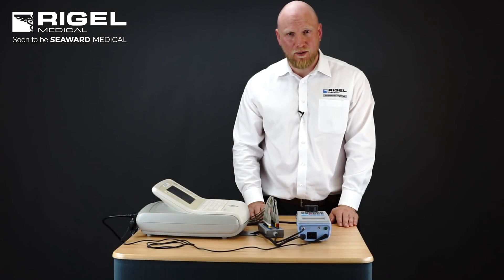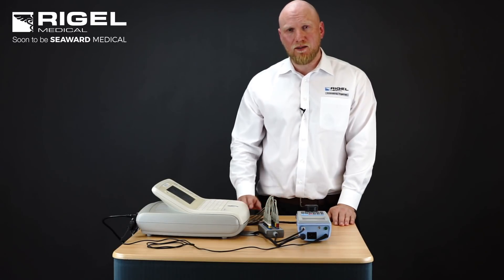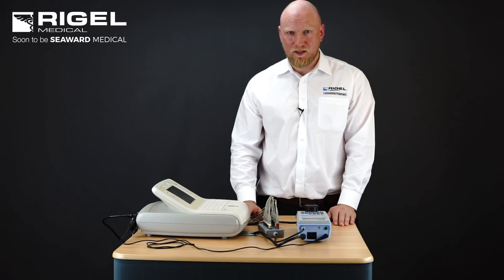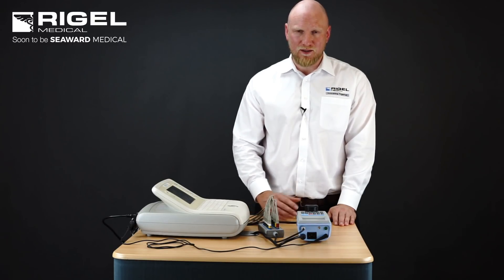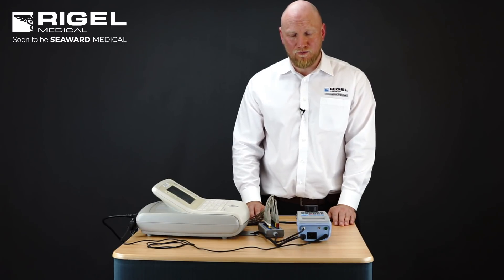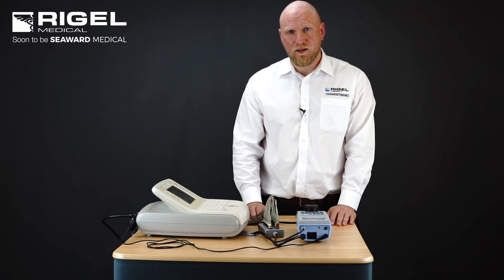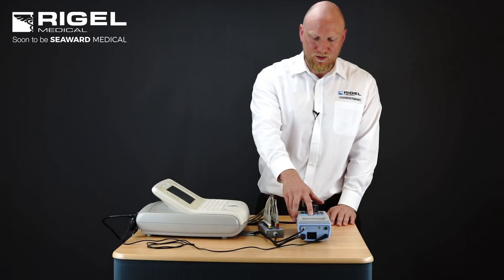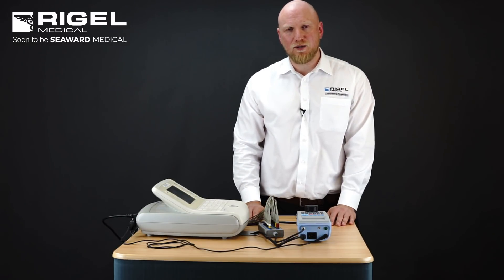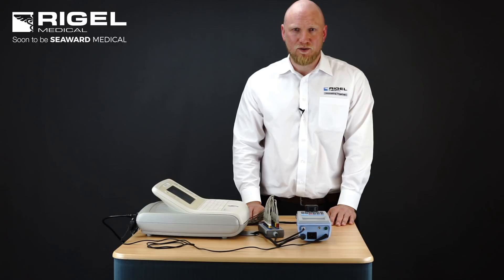Once the test sequence is complete and we're satisfied with the results, by monitoring the 288 Plus through its automatic sequence we can see the pass/fail thresholds and all of the readings on the screen, giving us an indication of passes or fails. We are prompted to enter user comments. Once satisfied with the testing, we can save the results to the 288's memory, or we have the facility to print out a label and a set of results from a Bluetooth printer.